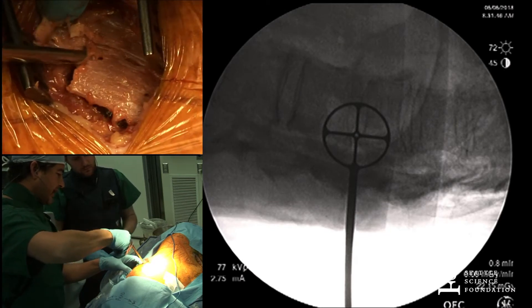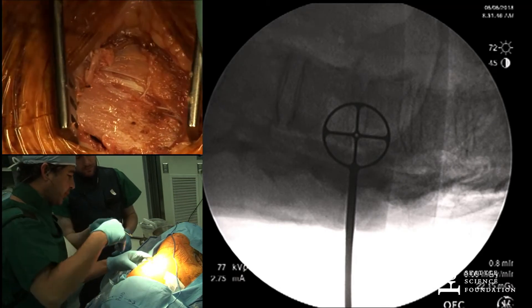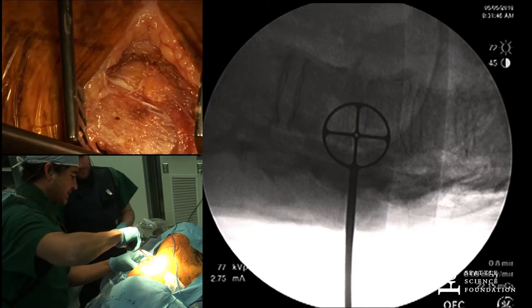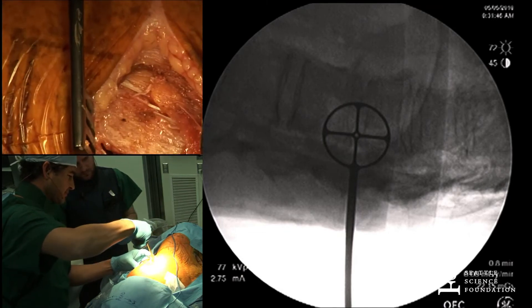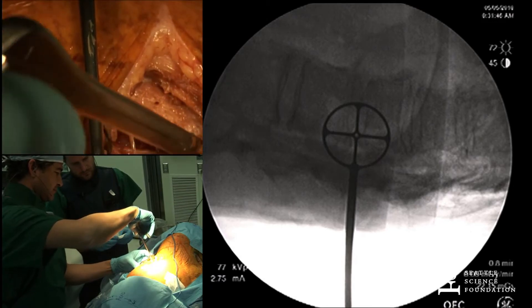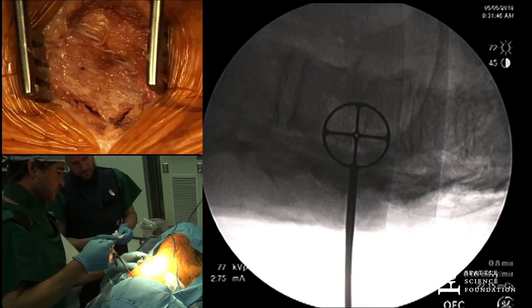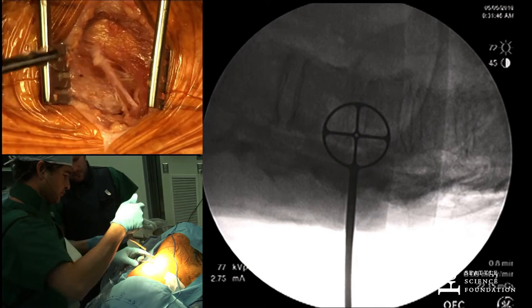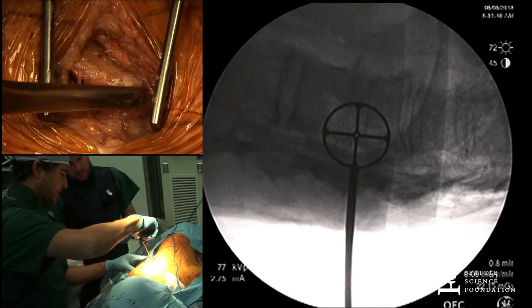I like using the Kerrison on the cadavers because it's so easy to get into the pleura. I use a B1 attachment — a craniotomy attachment — because it gives you a nice smooth cut. A lot of times I will plate these back on thin patients, women especially, for cosmetic reasons. For trauma cases where I've taken the rib out, I'll plate it back so you don't get a flail chest if they have other rib fractures from the trauma. The B1 makes a nice smooth cut that you can plate back together.